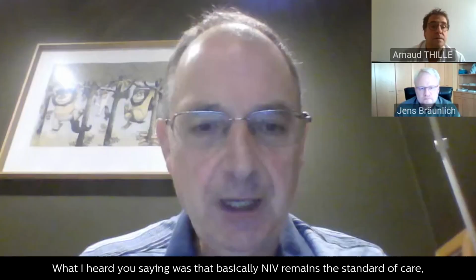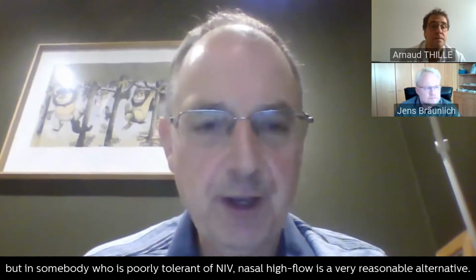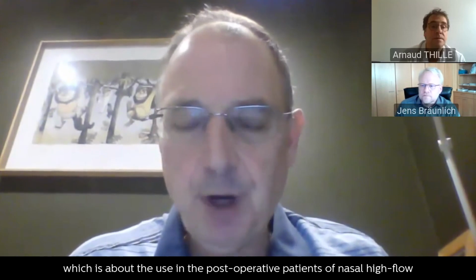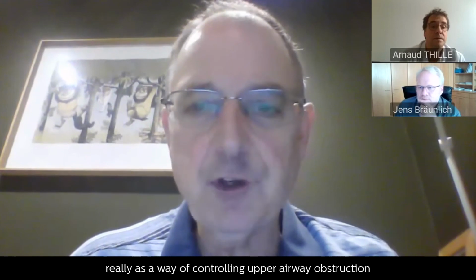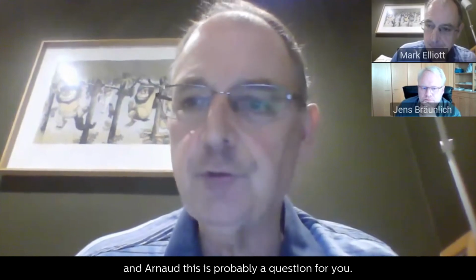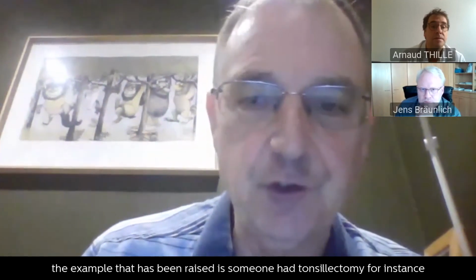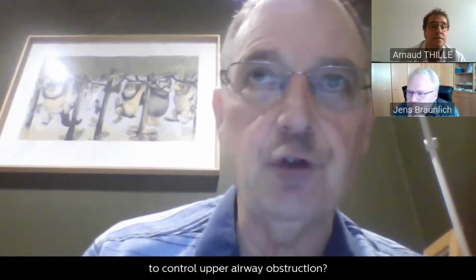What I heard you saying was that NIV remains the standard of care, but in somebody who is poorly tolerant of NIV, nasal high flow is a very reasonable alternative. There's one final question, about the use of nasal high flow in post-operative patients as a way of controlling upper airway obstruction. Arnaud, this is probably a question for you. For a post-operative patient with obstructive sleep apnea, for instance somebody who had a tonsillectomy, what pressure do you get from nasal high flow to control upper airway obstruction?